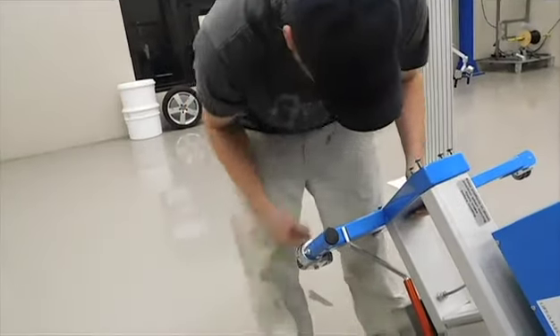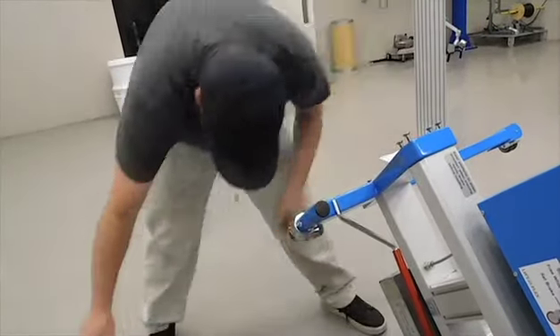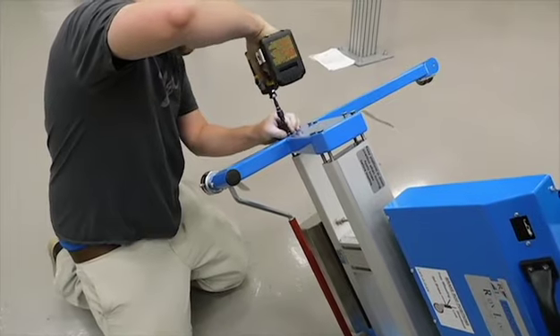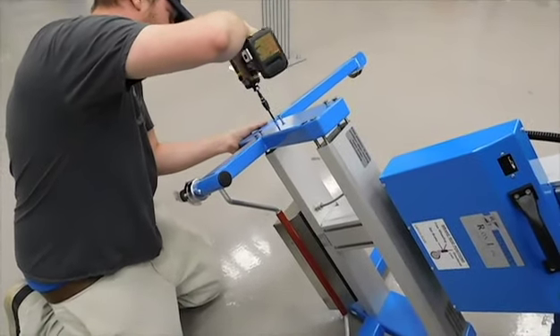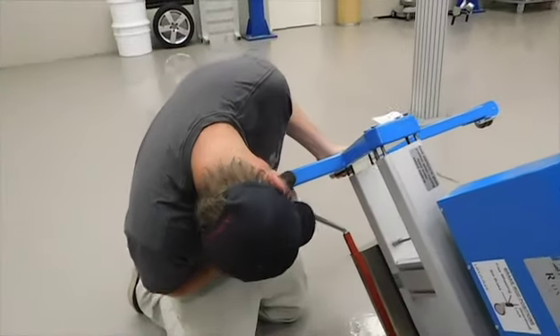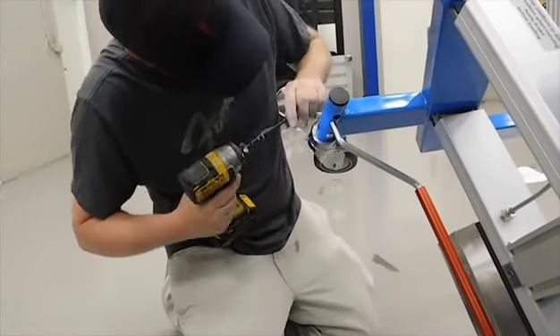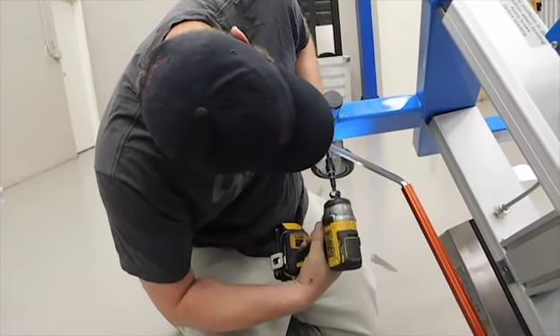Then you can pull this. Then you can tilt it up. Then you can loosen this. Then you can pull this.